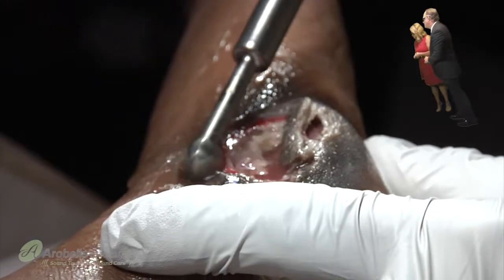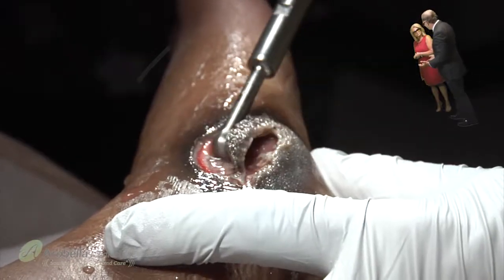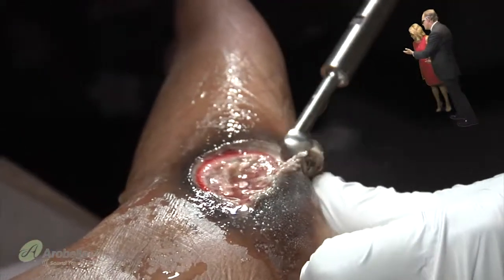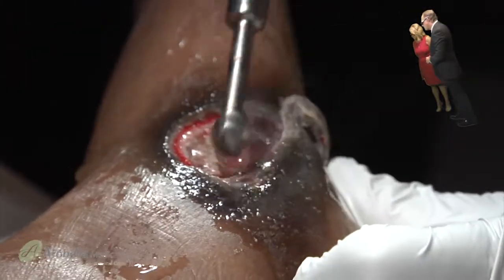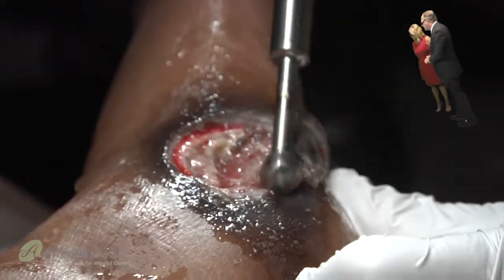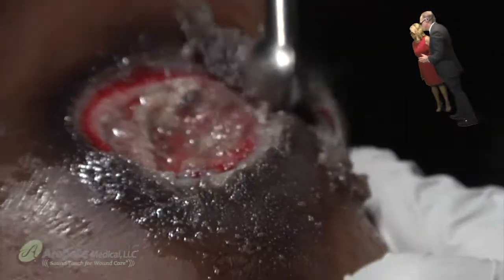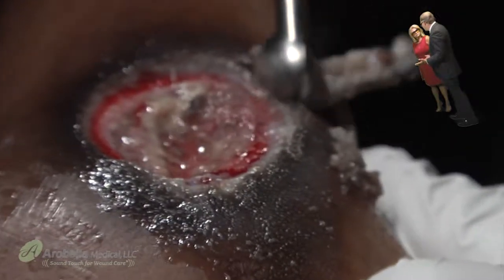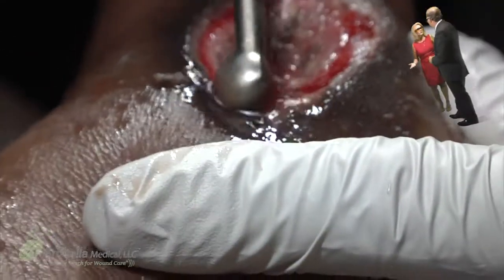Here's another wound — the big question is whether you can perform good excisional debridement with ultrasound. This is a good example: we're actually excising the margins of this ulcer prior to laying down a graft — in this case a graft jacket. Preparing the wound base with ultrasound is of paramount importance for the success of your grafting procedures, whether it's a living graft, a Dermagraft, an Apligraf, a skin substitute, or a collagen graft such as a graft jacket. With adequate wound bed preparation, you find better results with your grafts. Absolutely.